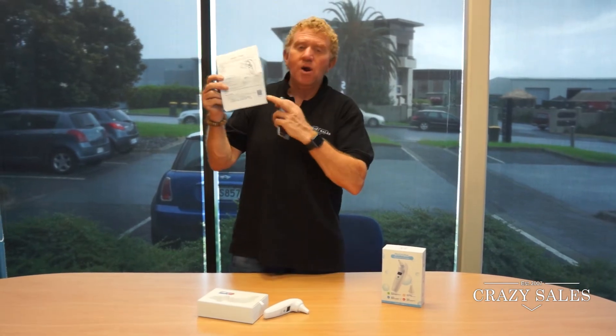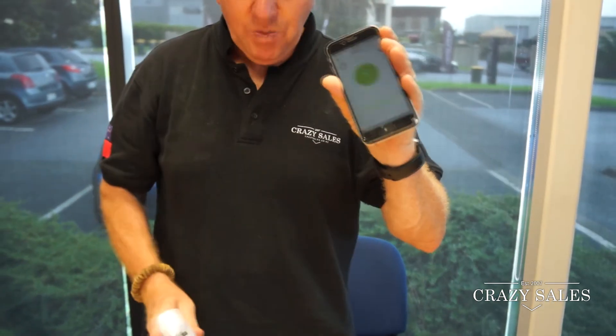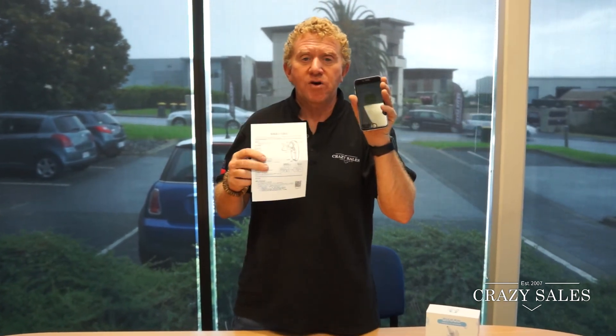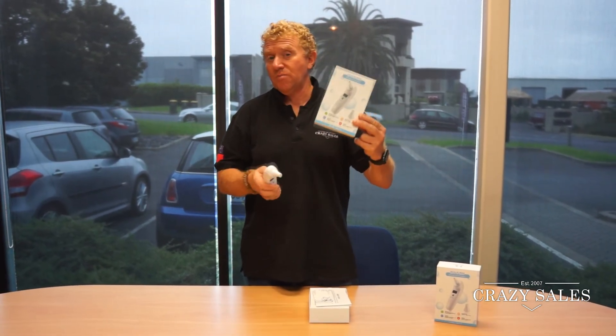If you scan this QR code here you get an app for your phone for this earpiece, so I'm going to explain everything on the app. Scan the QR code on the brochure and you'll get this app on your phone. Pretty cool — come to Crazy Sales to get yours before winter, otherwise you might run out of stock. Be quick.